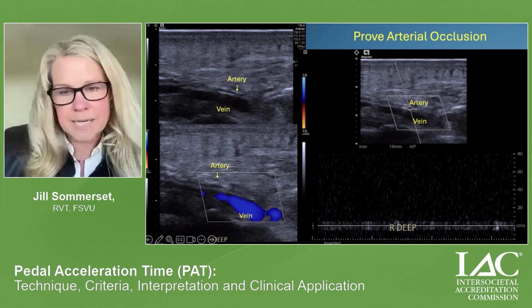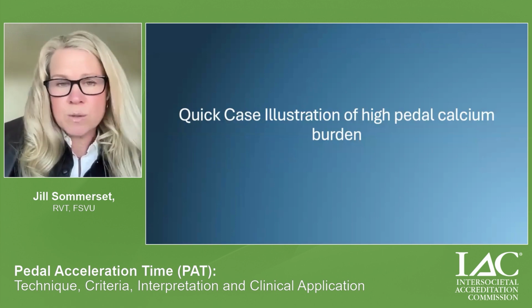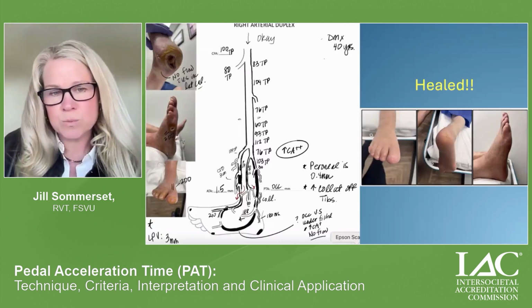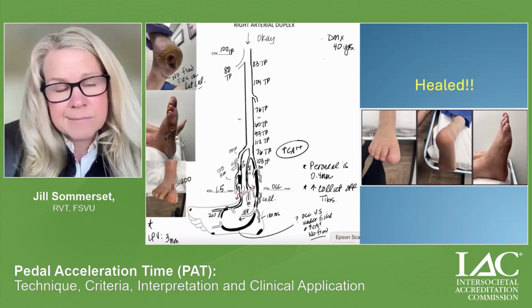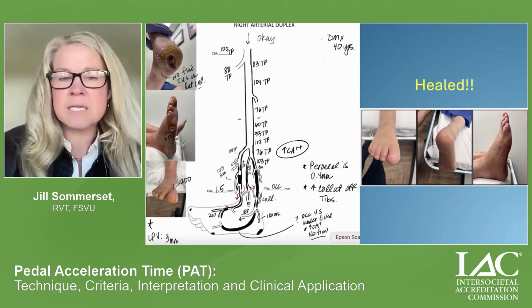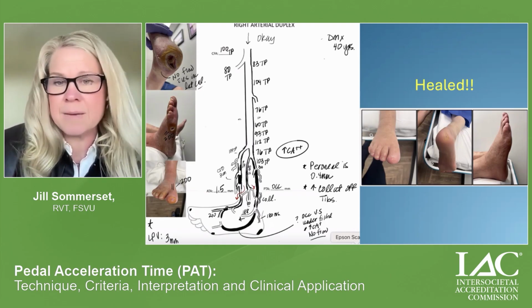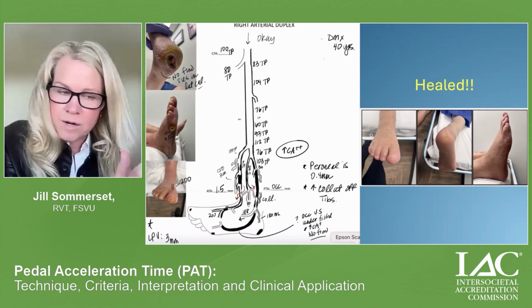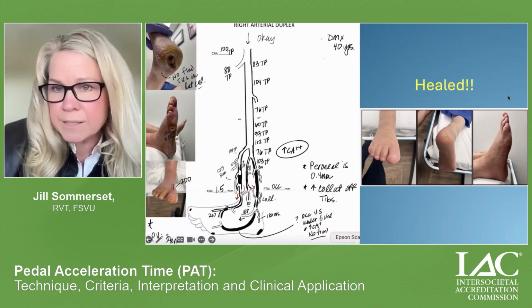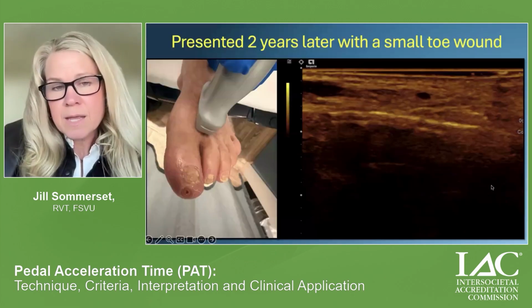So it is the same technique that we use in any other bed of the body. So I just want to show a quick case of a high calcium burden patient. This guy that I showed you with the heel wound, he has a very complex case, multiple wounds, a lot of tibial disease, a lot of pedal artery disease, and we were able to revascularize him and get his PAT from abnormal to now normal. It was class 3, class 4, and now it's class 1, 5 months later, and he had all wounds healed.